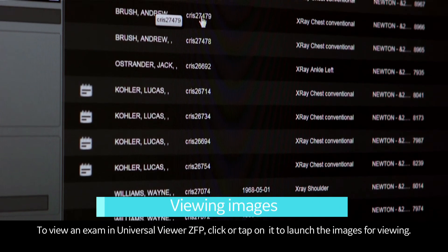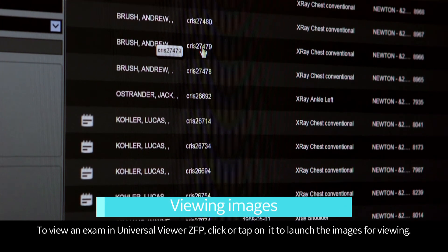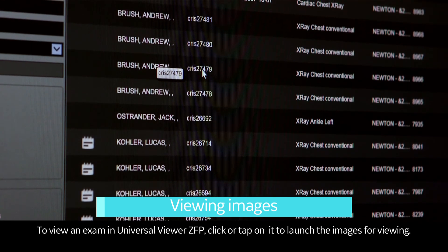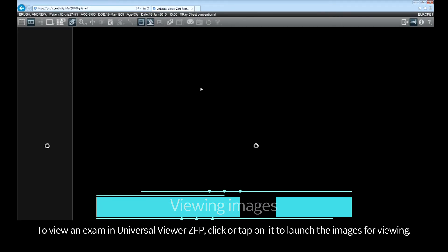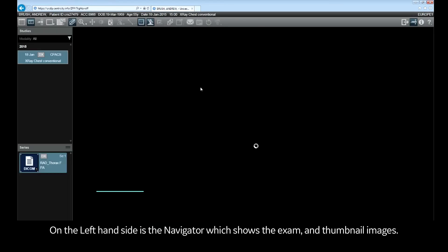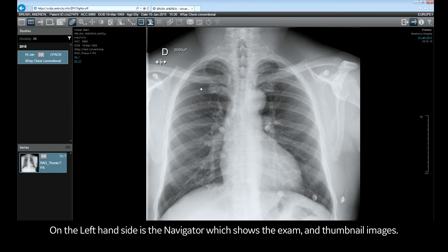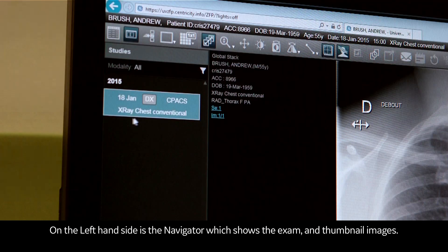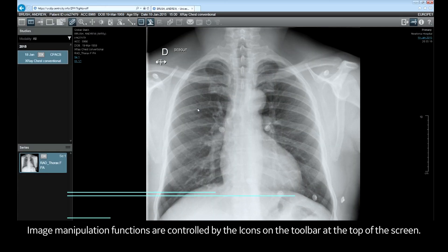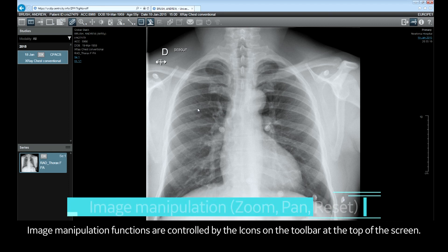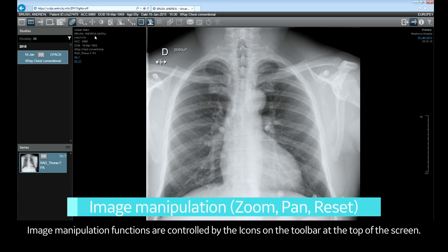To view an exam in Universal Viewer ZFP, click or tap on it to launch the images for viewing. On the left-hand side is a navigator which shows the exams and thumbnail images. Image manipulation functions are controlled by the icons on the toolbar at the top of the screen.